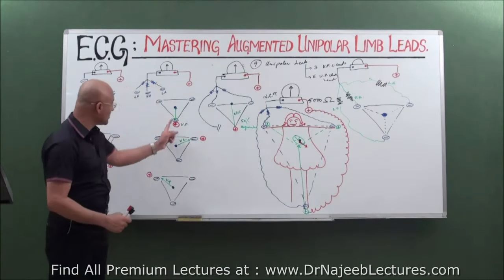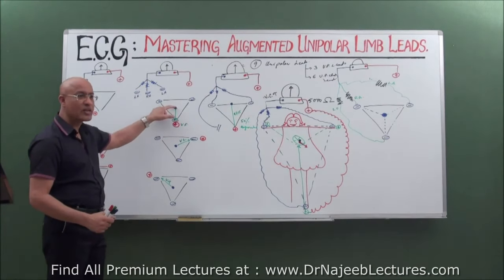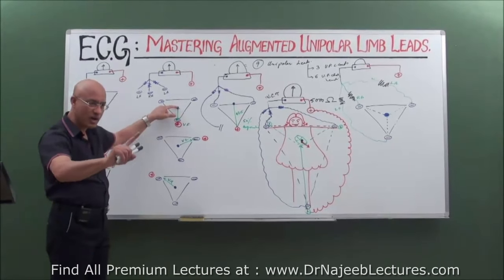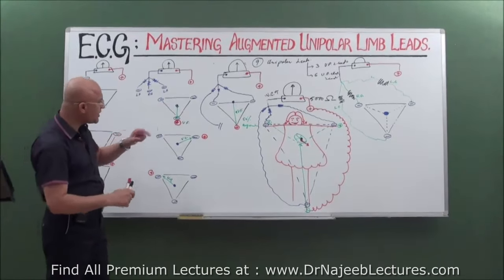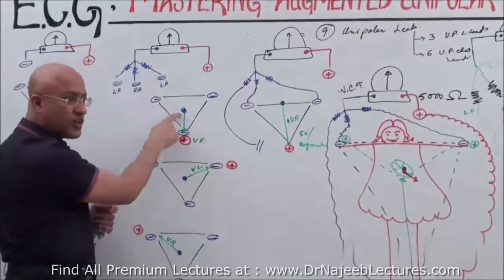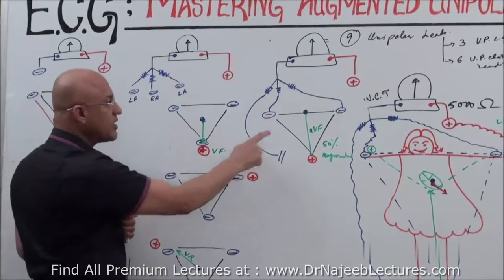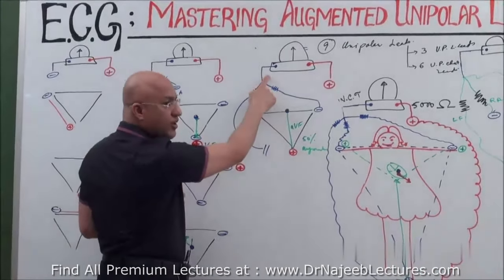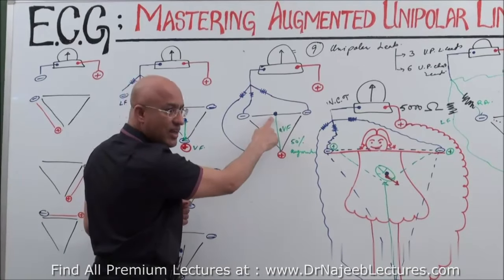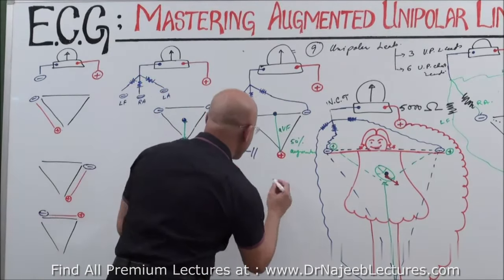So this view is for the top, towards the top. But actually you are at the bottom of the heart. That is what I want you to remember, not the other thing. Okay? Then Goldberger. So this is now gold. This was Wilson central terminal with what is this? Wilson indifferent electrode. What is this? This is Goldberger central terminal and this is Goldberger indifferent electrode. Clear? Then he modified with every arrangement.